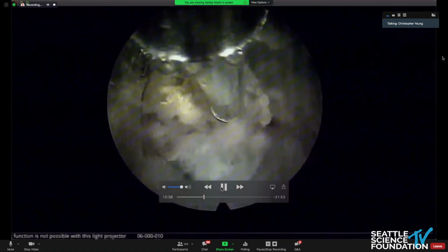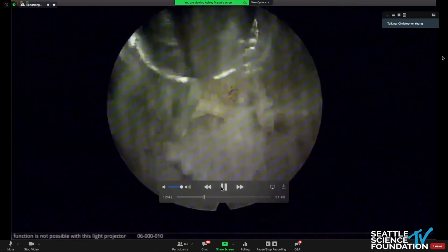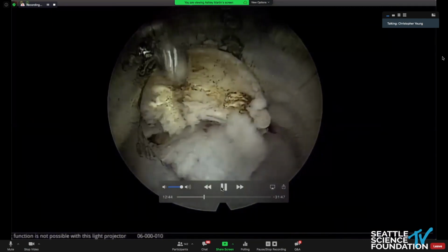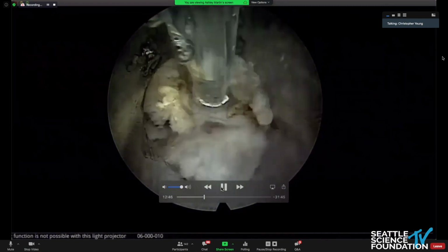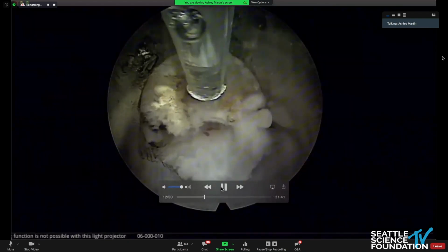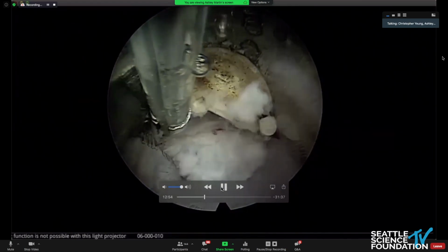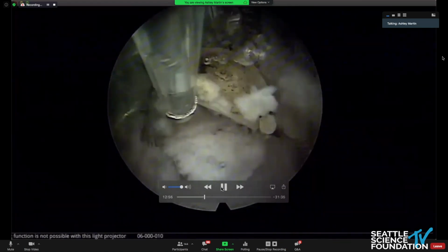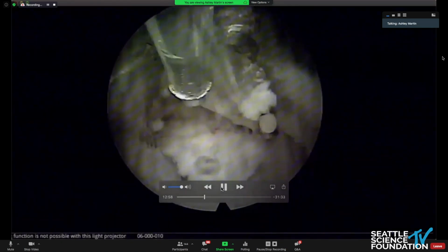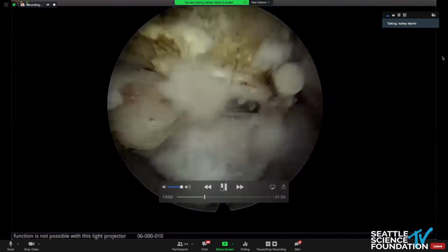And it also protrudes. When you make it protrude, it curves. So use it like a nerve hook, like you would typically use in a microdiscectomy to palpate things. The lateral extent of ligament of flavum. It's a very nice tool. One of the workhorses. Some posterior stenosis, just kind of removing some of that. Okay, you can see that epidural fat is peeking in right there.